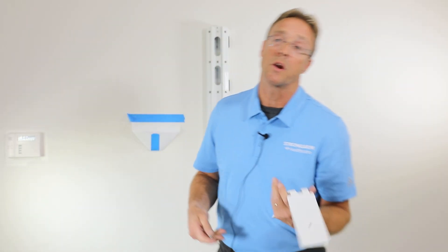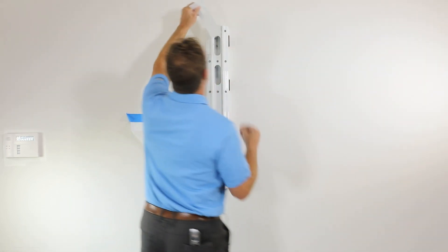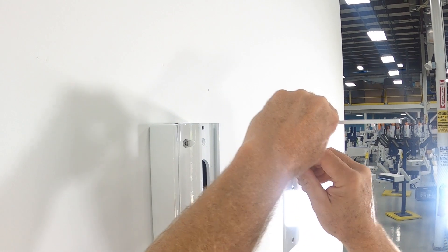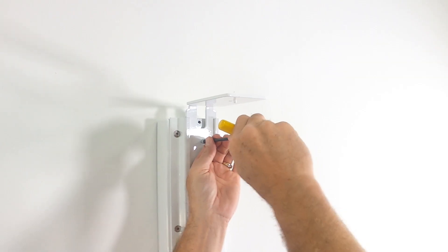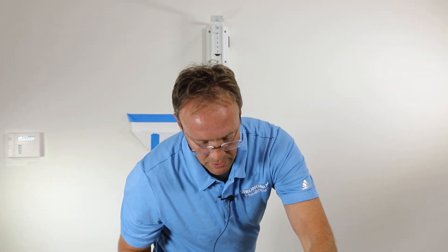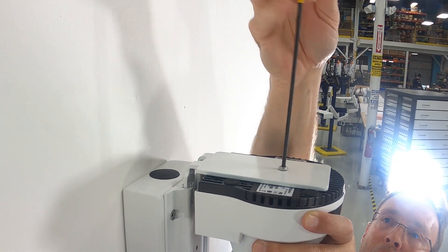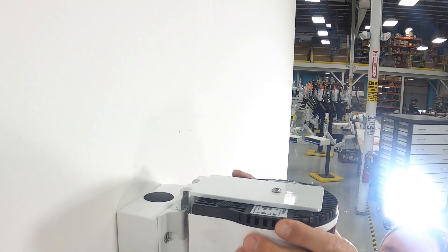So first we're going to go ahead and install the camera bracket into the wall mount. And then we will install the camera — make sure it's nice and secure.